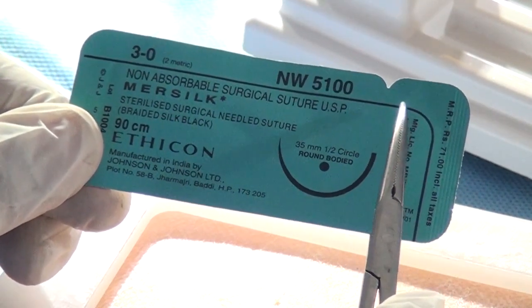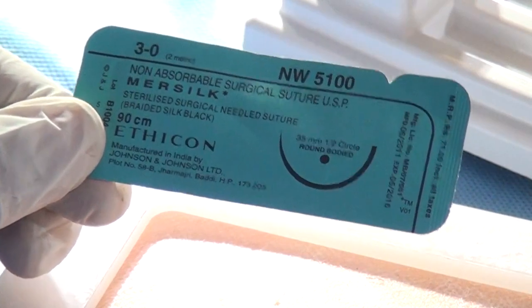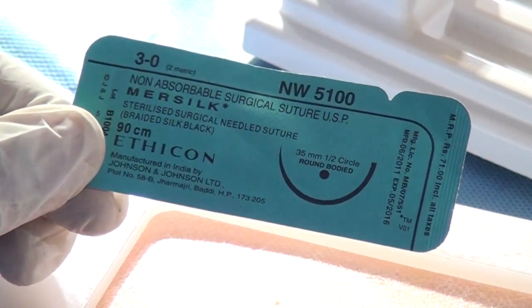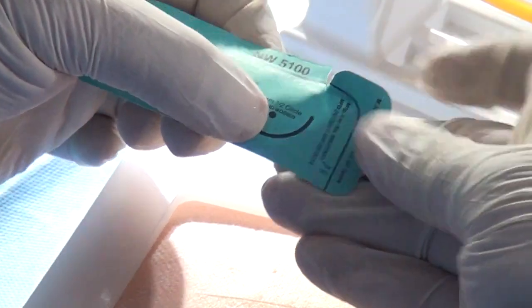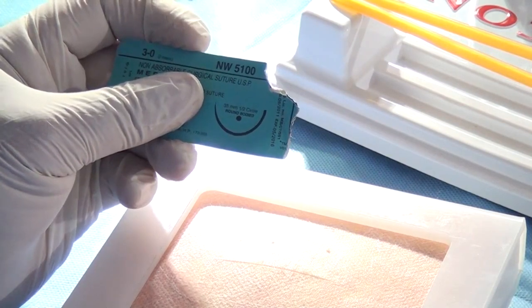But a common mistake that happens is when you use the scissors and go zap, zap, zap right across. All of us have done it at least once. And as you cut through, you will soon realize the suture is all over the place, cut into pieces. What is the right way to open a wrapper therefore? Watch it. I'll keep it in vision. I'll tear it down to the line. Line is where the suture is, mind you. I'll go along the line and pull it off. Rest is very simple. I'll have the wrapper opened. And get the suture out of the pack.